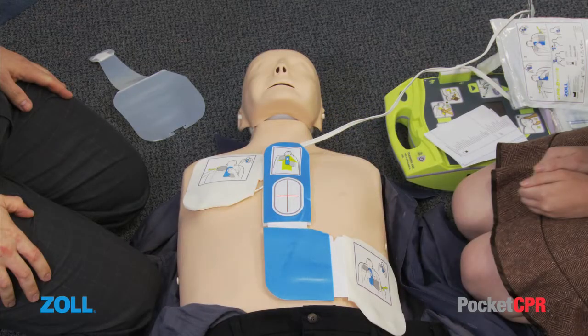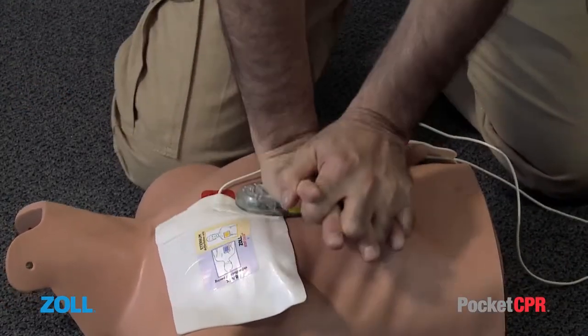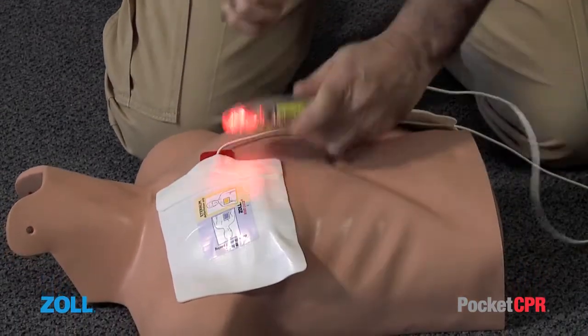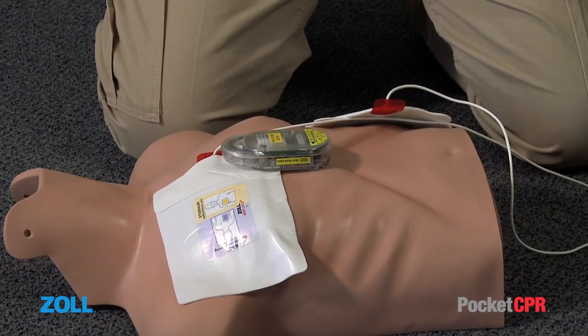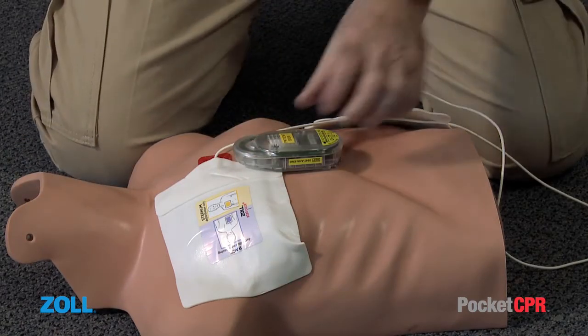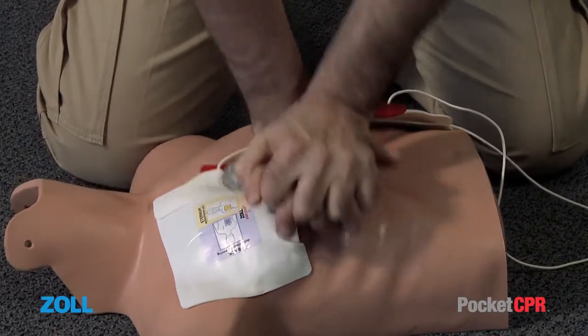The PocketCPR may be used together with an automatic external defibrillator, or AED, which may have its own voice prompts which the user wishes to hear. In this case, turn the PocketCPR upside down. All voice messages and the metronome will stop. The voice message, "Analysis halted," will play once, to indicate the unit is no longer providing CPR feedback. To restart its audible CPR feedback, turn the PocketCPR right side up and begin compressions.